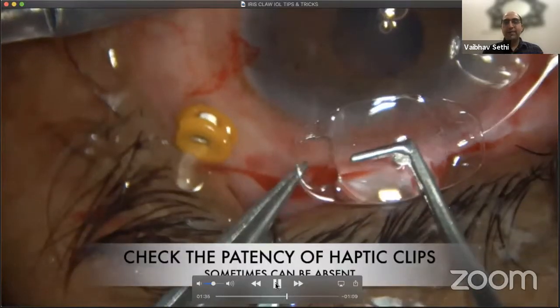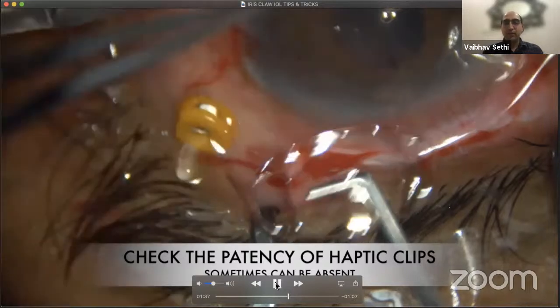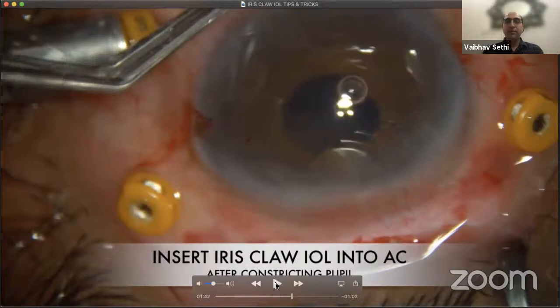Now in my case, I'm going to be placing an iris claw lens. Very important: before you go into the anterior chamber, check the patency of both sides, because sometimes it might be fused. You never know, and then you're stuck. If one side is enclaved and the other is not, then you are in a catch-22 situation. So check the patency on both sides. Sometimes it can be fused, a manufacturing defect. So just hold it, be comfortable, place in pilocarpine, place in visco.